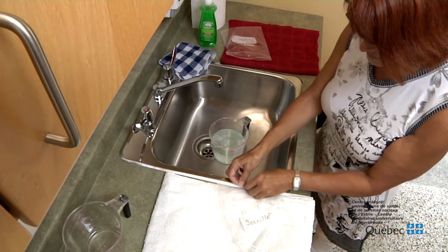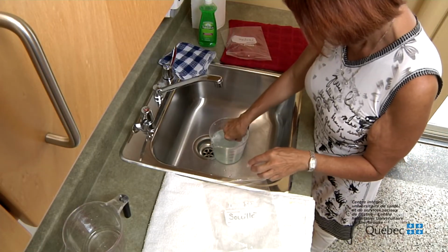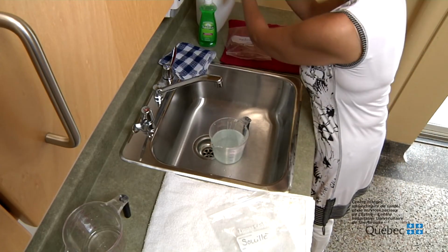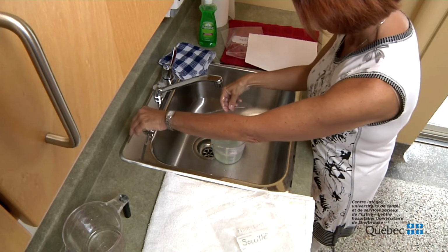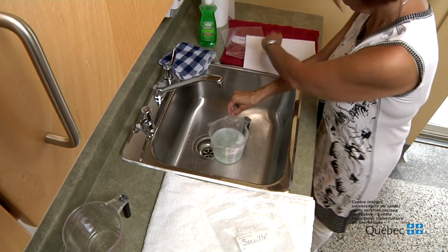At the end of the day, clean all of the catheters that you have used that are in the bag marked soiled. Wash them one by one with soapy water, making sure that they do not come into contact with the sink. Once a catheter has been washed, rinse it and dry the outside with a clean towel or paper towel.